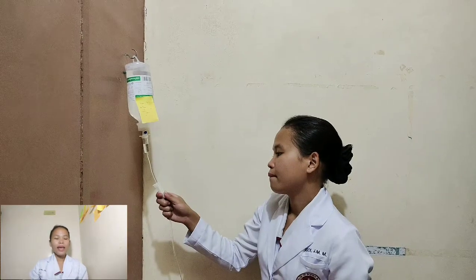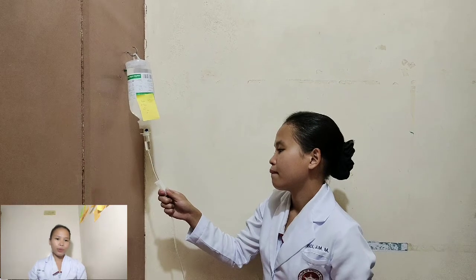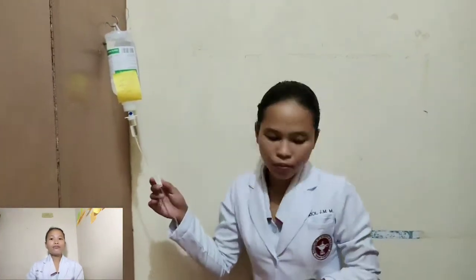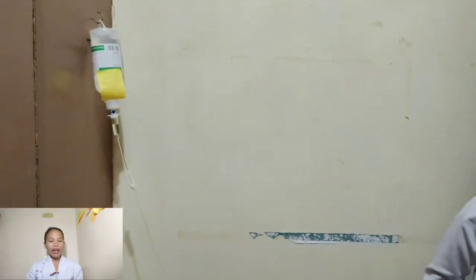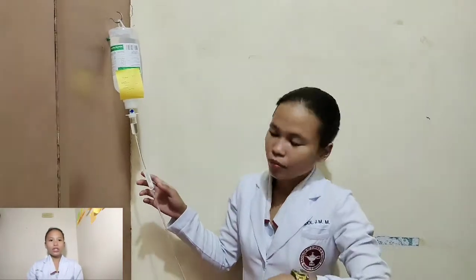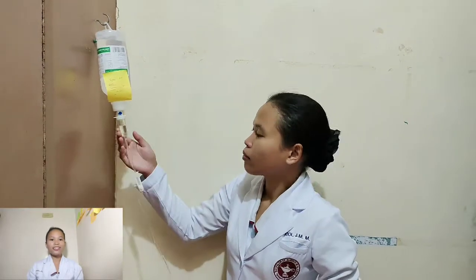Adjust the IV clamp as needed and recount the drops per minute. This regulates the flow rate into the drip chamber. Monitor the IV flow rate at frequent intervals and the client's response to the infusion. This provides for observation of the IV infusion and the client's response.